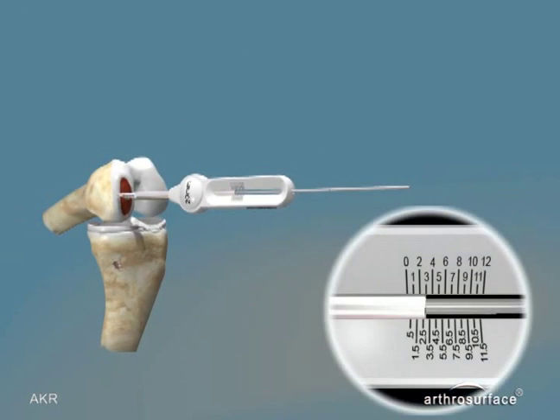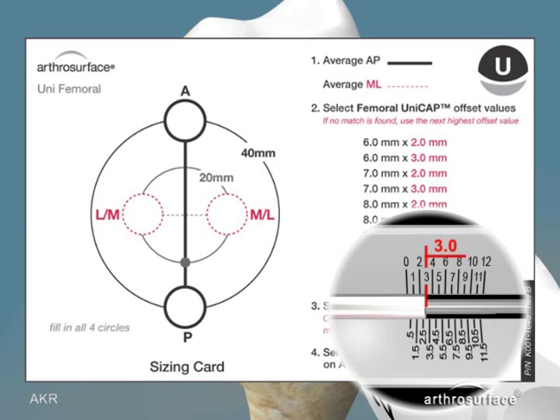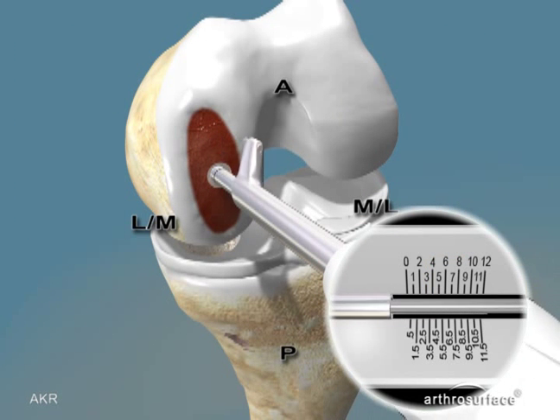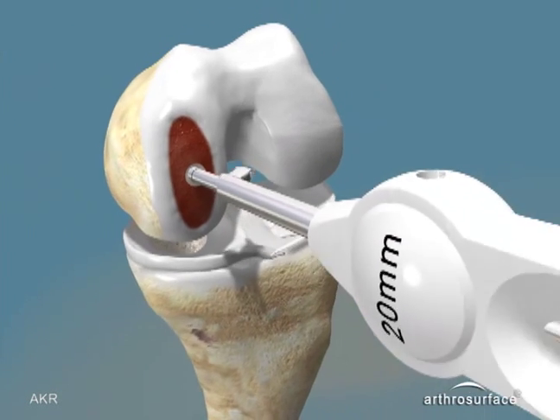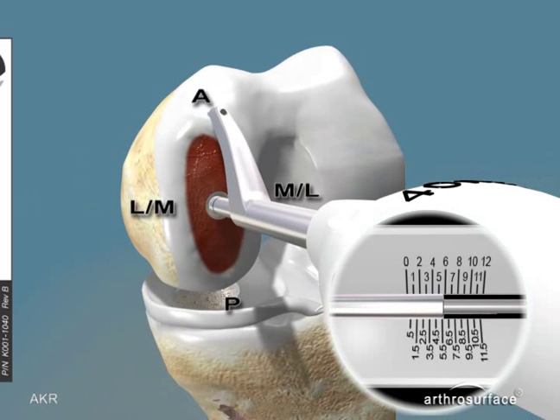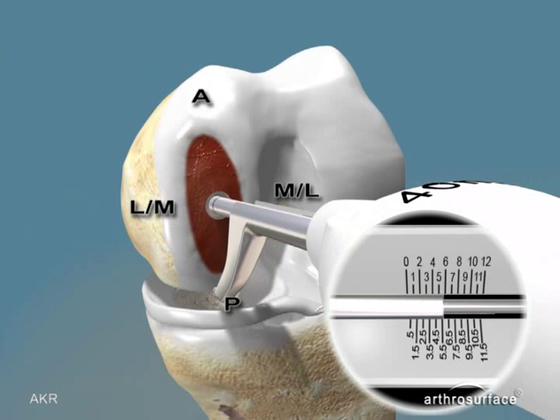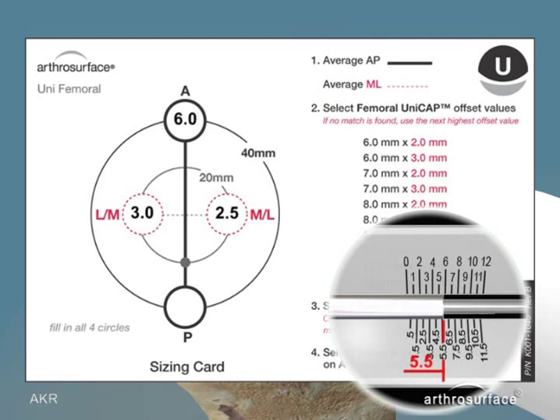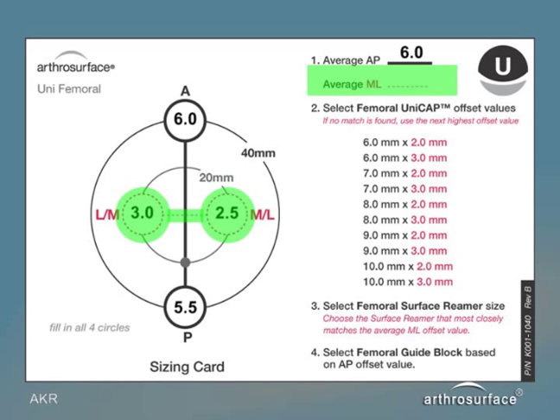Using the medial to lateral contact probe over the centering shaft, place the contact probe on the medial side and record the number — in this case 3.0 millimeters. Placing it on the lateral side, the recorded number is 2.5 millimeters. Remove the medial to lateral contact probe and insert the anterior to posterior contact probe. The anterior number is 6.0 millimeters and the posterior number is recorded as 5.5 millimeters. Determine the average anterior-posterior number, in this case 6.0 millimeters, and determine the average medial to lateral number, which is 3.0 millimeters.